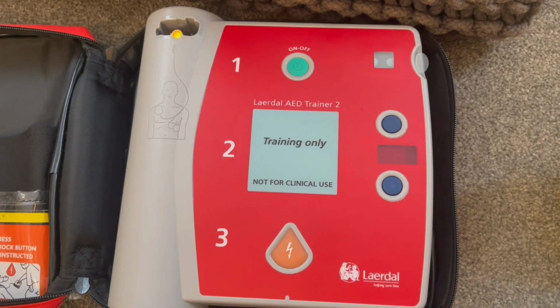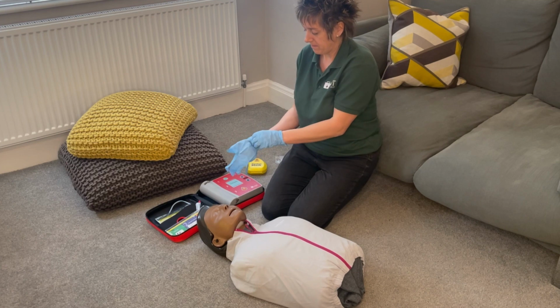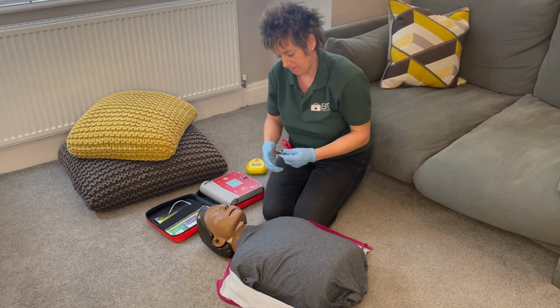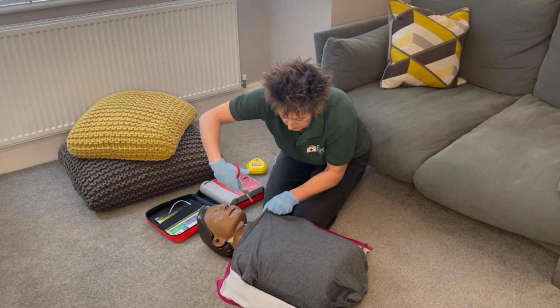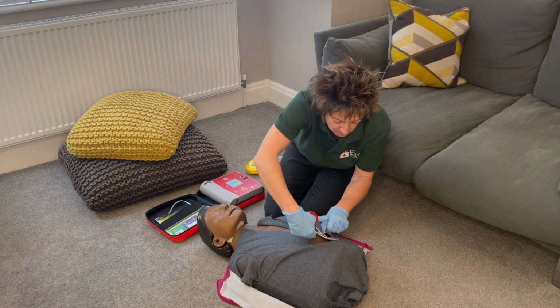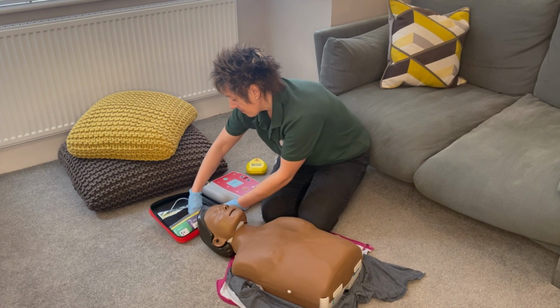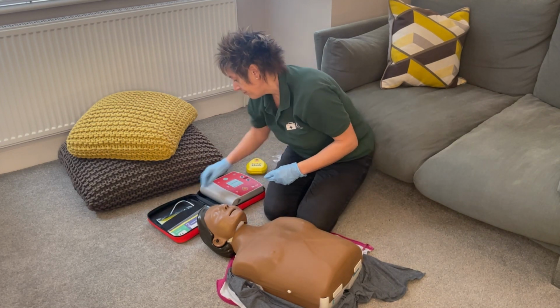Apply pads to patient's bare chest. The first thing I need to do is have a naked chest. So I need to remove the clothing off this casualty. So I'm going to unzip the jacket and then I'm going to use the scissors and place a cut at the top of the t-shirt. Might try and rip it. If that doesn't work, I will then keep cutting all the way down. Remember, neck down to belly. I'll make sure that they're not hairy, and if they were hairy, I need to shave them where the pads would go. And maybe dry them if they're very clammy or sweaty.